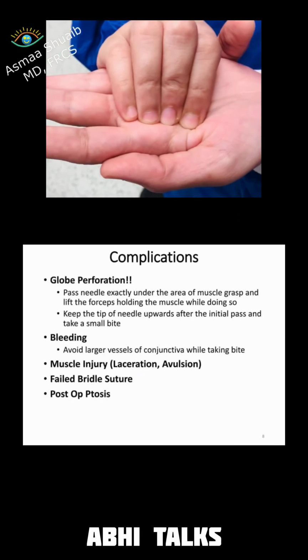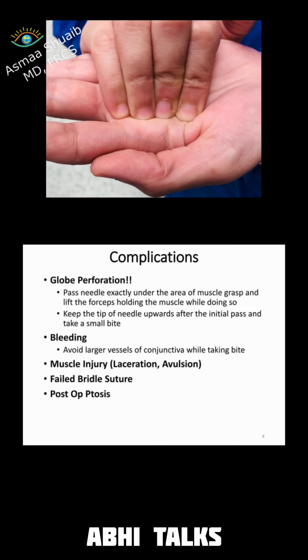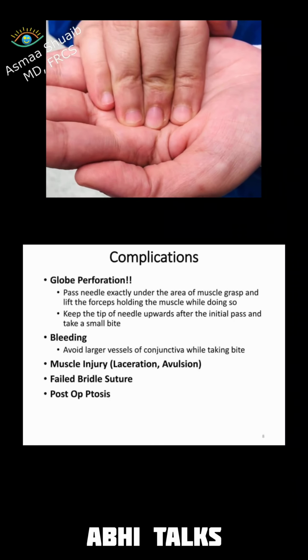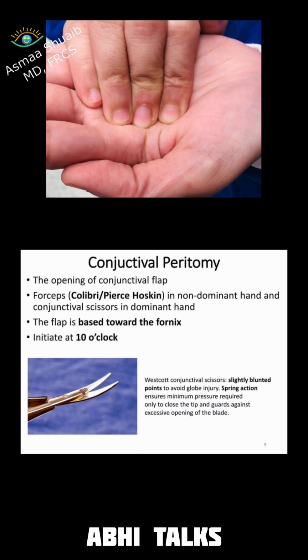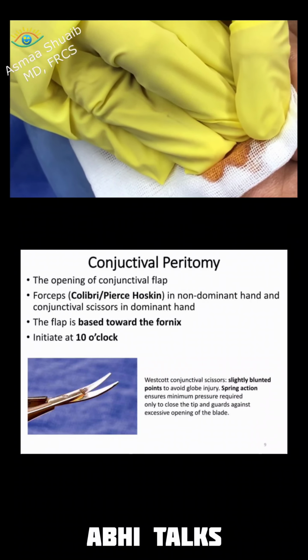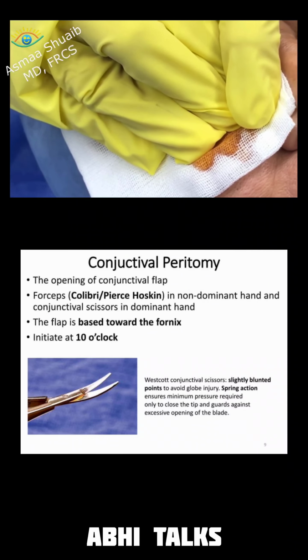And then start doing massage by making pressure until the tips of your fingers blanch. Count for 10 seconds while doing the pressure and release for 5. This massage is very important to release any retrobulbar positive pressure and to help the anesthetic agent to diffuse within the surrounding tissue.